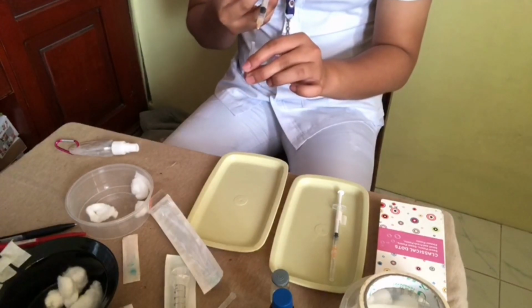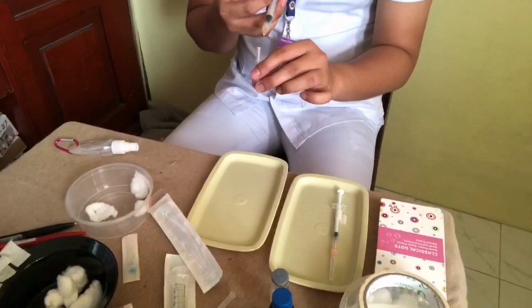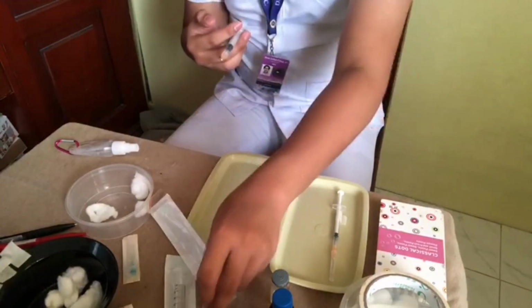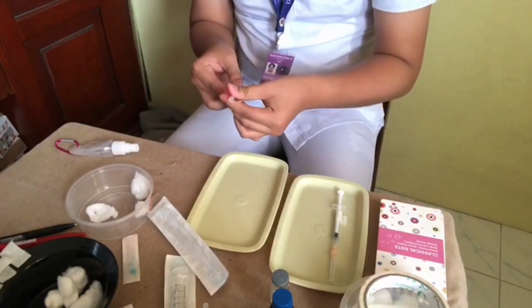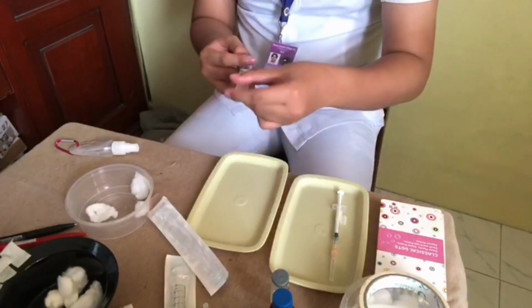Okay, so after that, we'll dispose of the needle by placing it in the sharps container and replace the filter needle with a regular needle. I am going to remove it, discard it and replace it with a new needle.